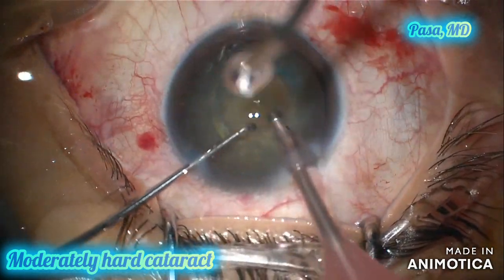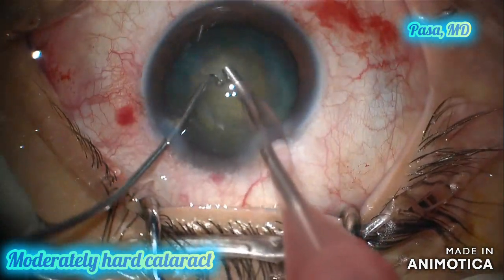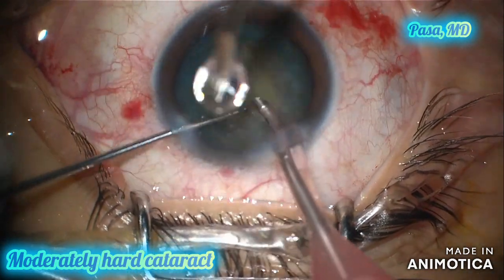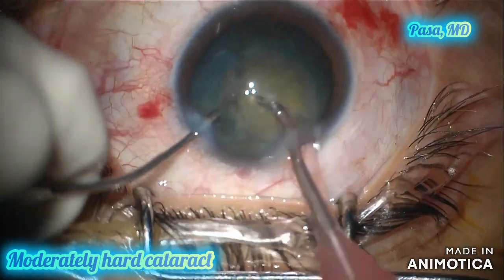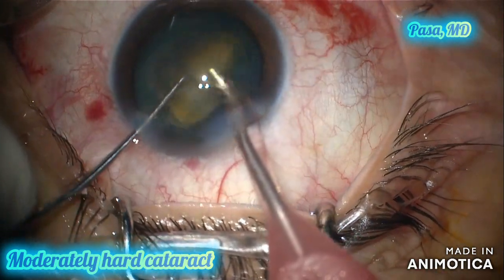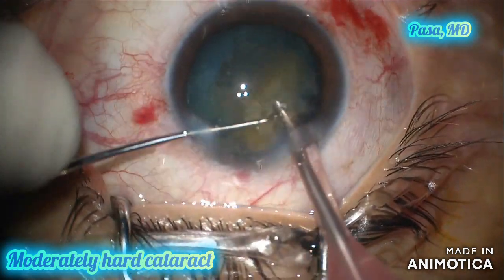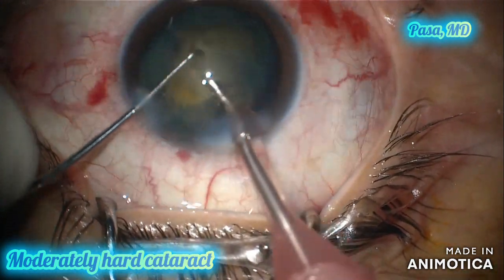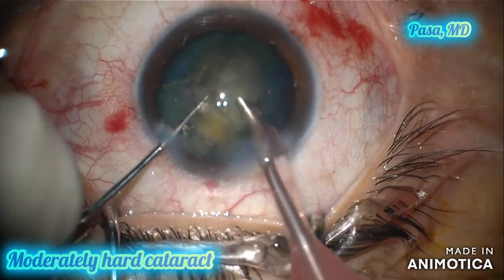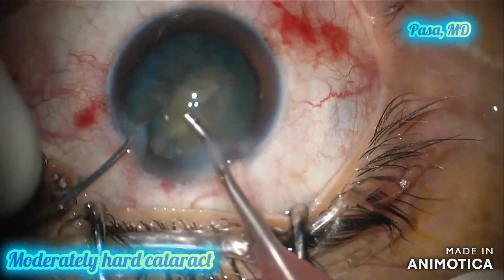Then a direct chop — a horizontal chop — going to the equator, maneuvering the two instruments across the equator, then across the center of the nucleus, and cracking it down. I didn't get the full crack, but debulking is working just fine. This is a nuclear cataract, probably plus two, and the patient is in the early 50s, so it's not too old. The phaco is going just fine.